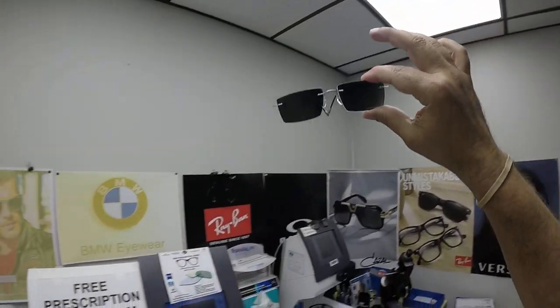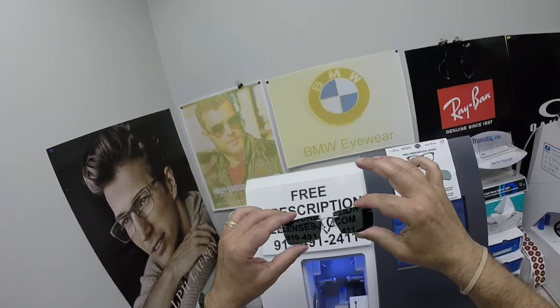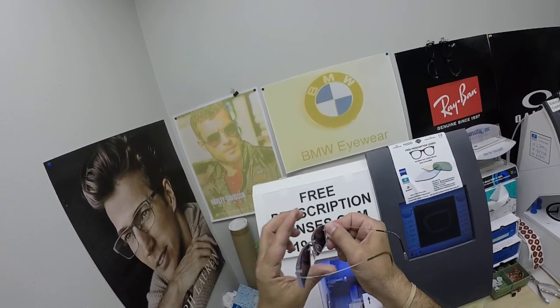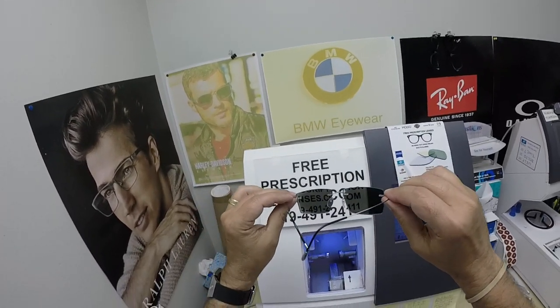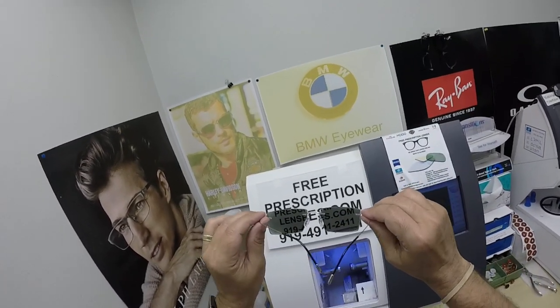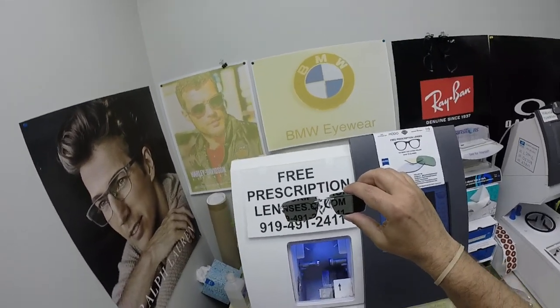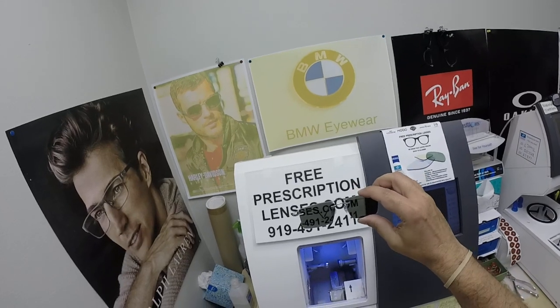The only time they won't work perfectly is if you're behind the windshield of a car. Your windshield absorbs the sun's harmful ultraviolet rays that would cause your dashboard to crack from sitting in the sun all day, and that's why they don't turn dark in a car. These new Photofusion X series — the X edition from Zeiss — will get up to 30% dark in a car.